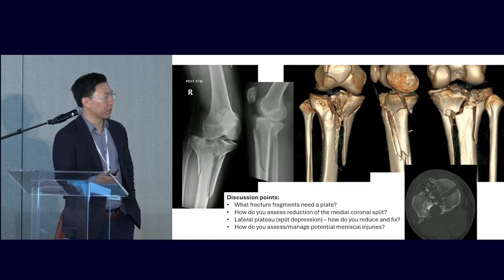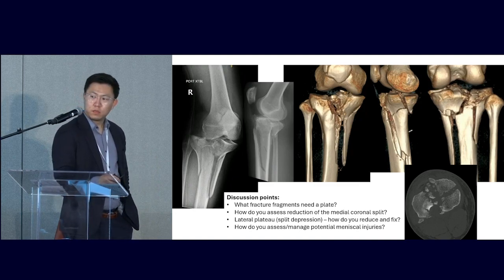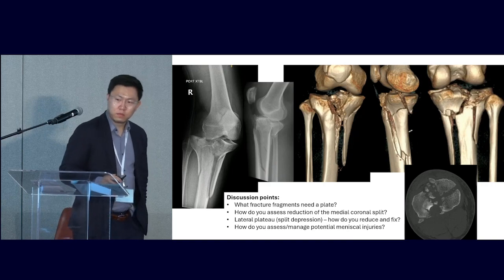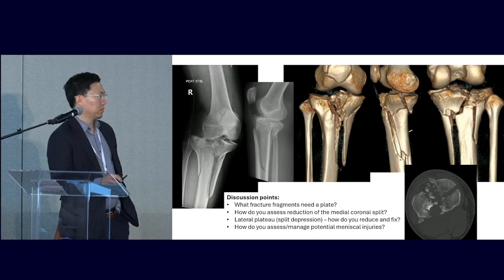Posterior medial, you're going to reach up and clamp that, because those articular surfaces don't look depressed. Actually, I would start at the distal piece, key that first, so you're building your proximal segment off an intact tibia. So you're going to bring this over and put a couple of lag screws. That's my first step. Then you're going to go up here and reduce that.